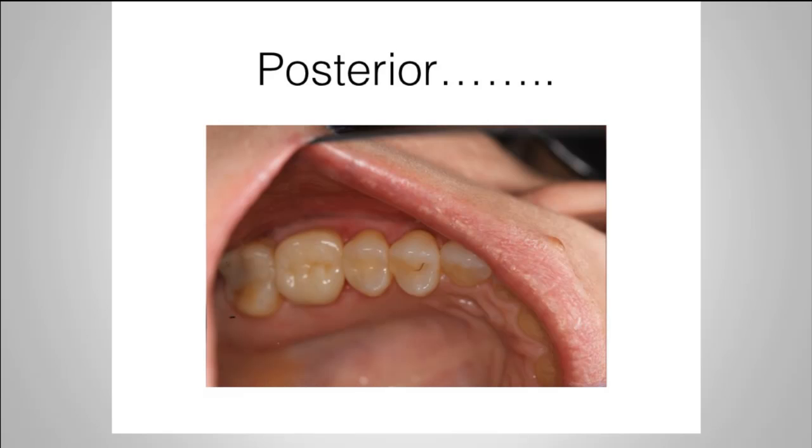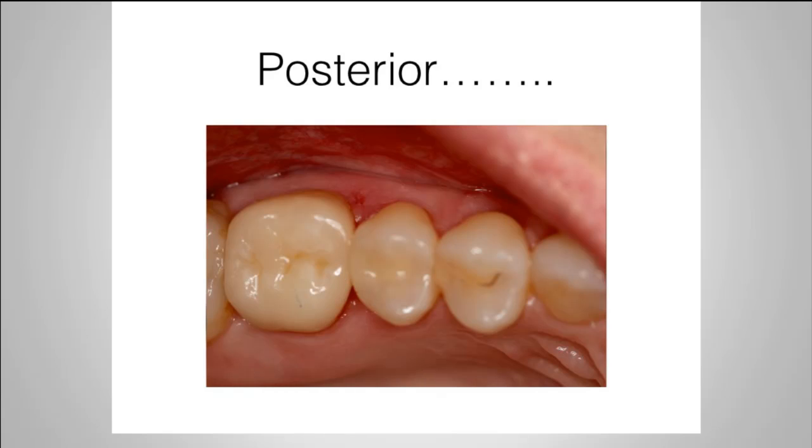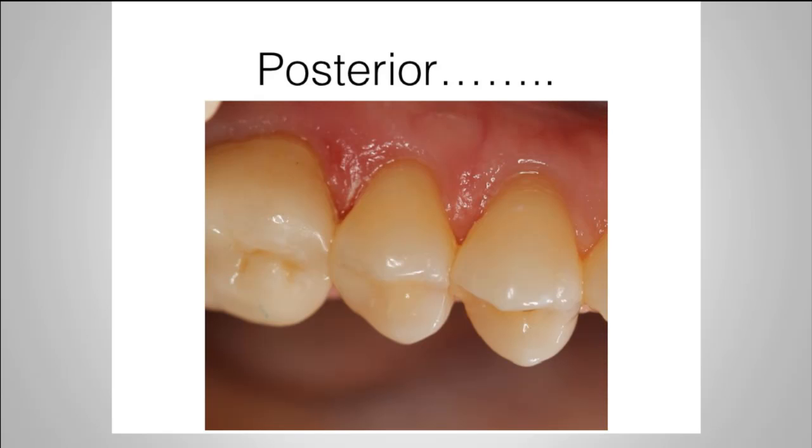This is the final restoration. As you can tell, taking a look, you don't see any marginal degradation, no white lines, none of those things that you would see from any type of situation that had extreme shrinkage and pulling away, but really an overall nice effect. Chameleon wise, I gave it a little bit different angle. This is the same shot I showed earlier, but I wanted to give you a little bit of a chameleon effect and how the light bounces off these types of materials to give you that overall refractive index, much like enamel, and pretty much a lifelike restoration that goes relatively easy.